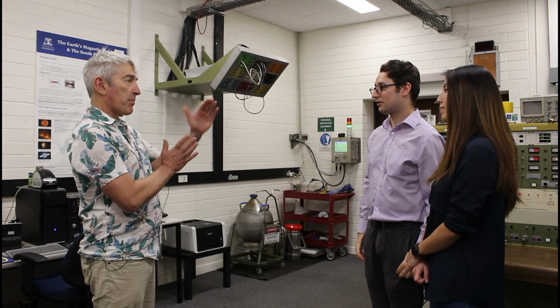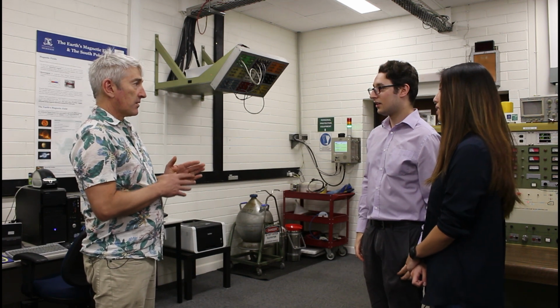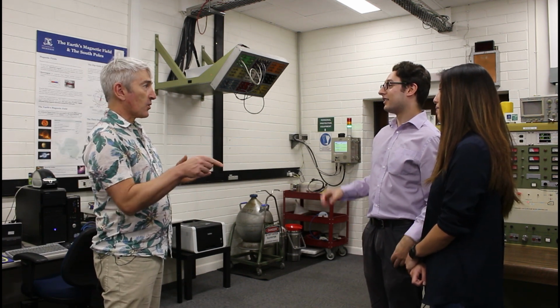And our project here is working on the prototyping and demonstration of the idea of going round a bend while transporting a large range of beam energies and having the same endpoint and the same focusing properties overall. Right. And that's quite a challenge. Right. It's kind of like city bypasses and freeways and shortcuts. Yeah, exactly. For the slow ones.